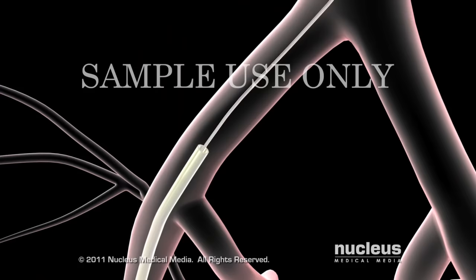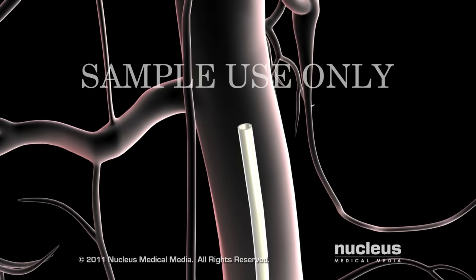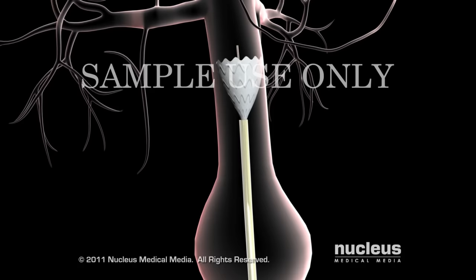A catheter or hollow tube will be passed over the guide wire and pushed toward your aneurysm. Using live x-ray pictures as a guide, your surgeon will pass an endovascular stent graft, a compressed fabric and metal tube, through the catheter to the aneurysm.